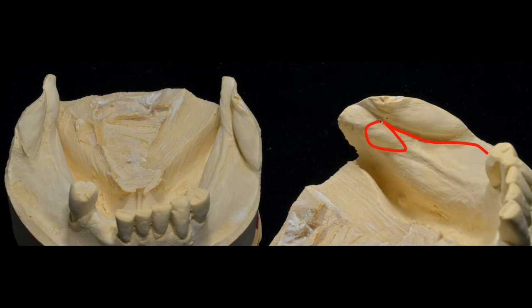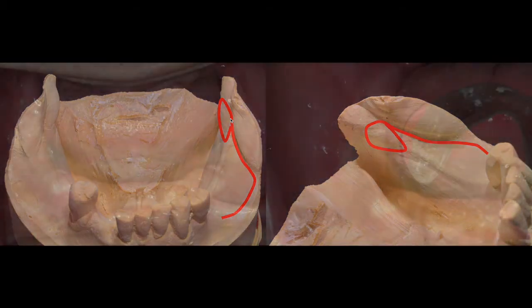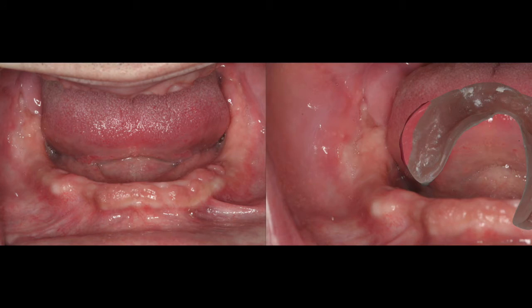So this one is showing a very concave M-plane shape. And this is another view. There is a pear-shaped pad, and then buccal to distal of the pear-shaped pad is called the M-plane, and this particular case shows a concave M-plane contour. When your prosthesis violates this M-plane, it causes a sore spot or discomfort to the patient.